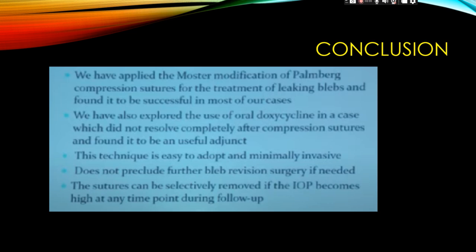The technique is easy to adopt and minimally invasive. The sutures can be selectively removed if the IOP becomes high at any time point during follow-up.